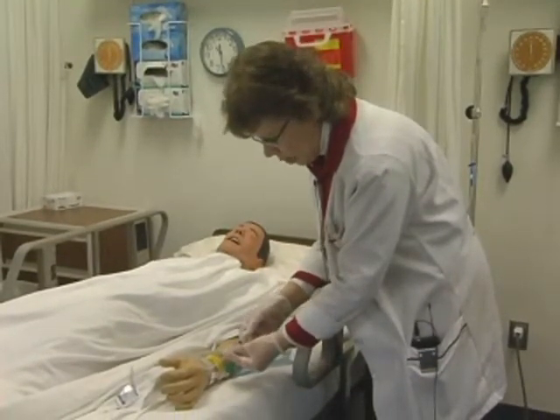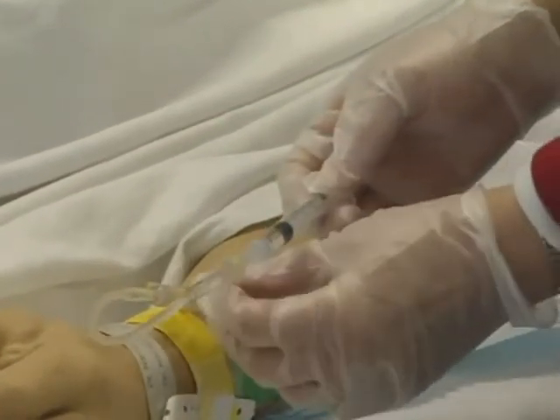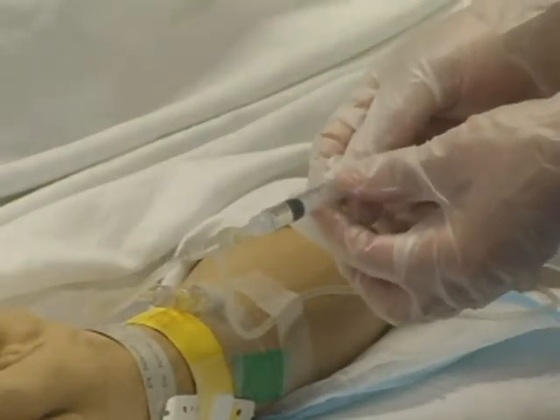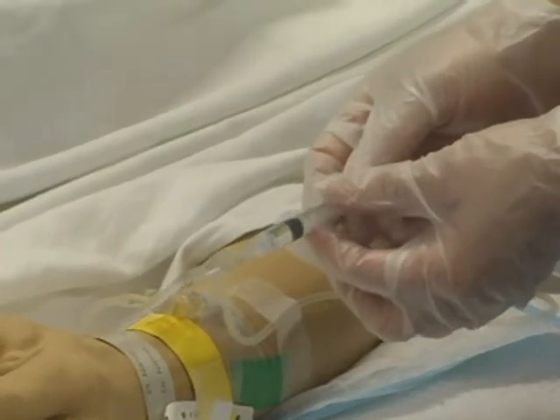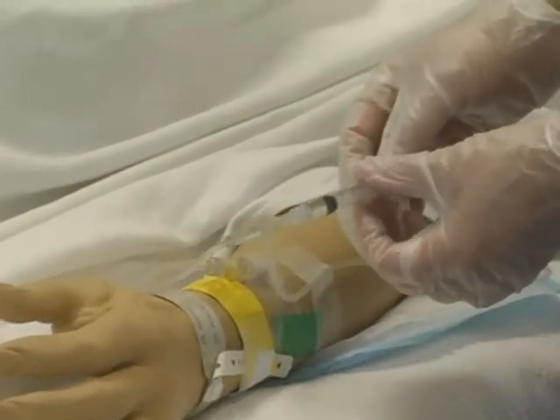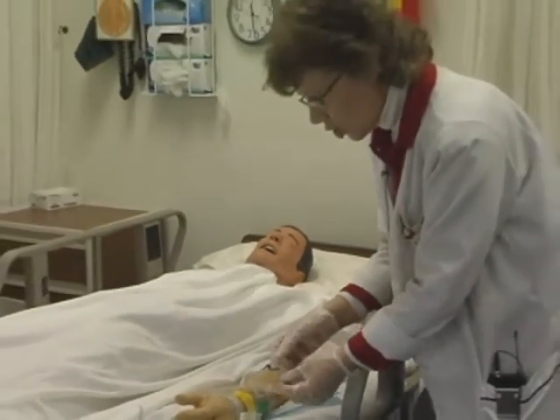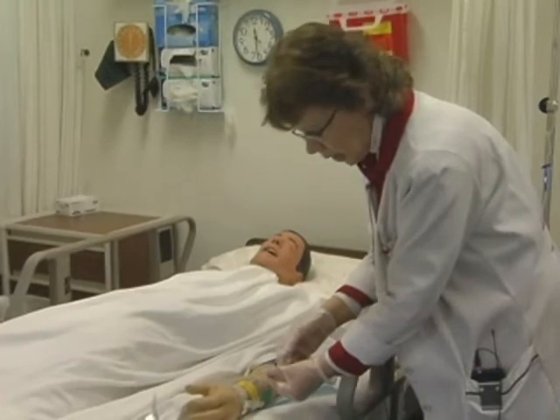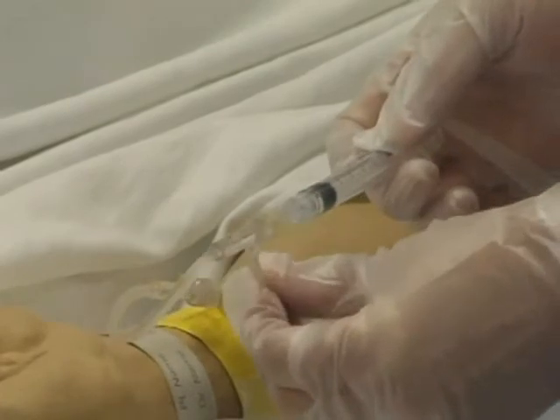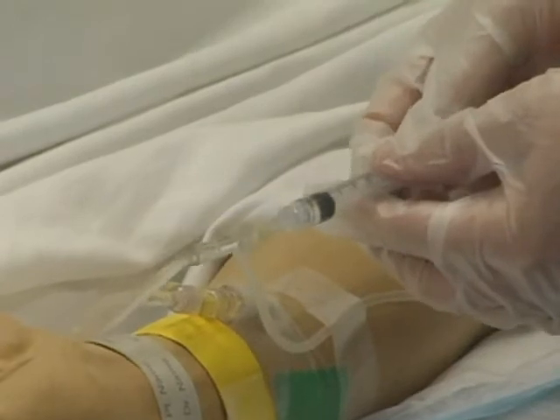So I'm going to clamp, push a half ml, release, and check to make sure I'm dripping. And I am. I'll wait another 30 seconds. While I'm waiting, I can be assessing my patient for any side effects. Sometimes with IV medications, the reactions you get are quicker, especially if it's a heart medication and he's on a monitor. You might see those changes right away. It's time to give it again, so I'm clamping, pushing, releasing, checking, still dripping. How are you feeling, Mr. Wagner?